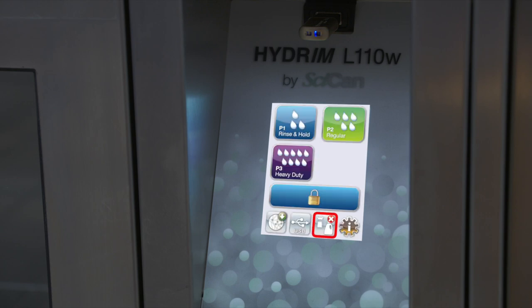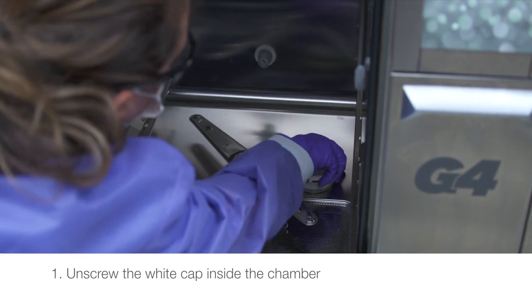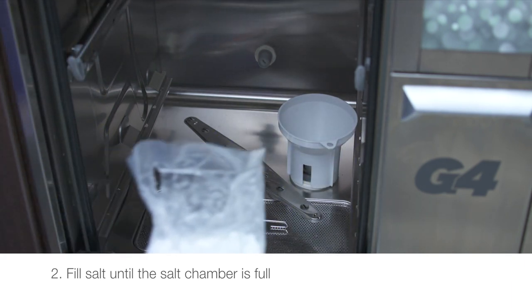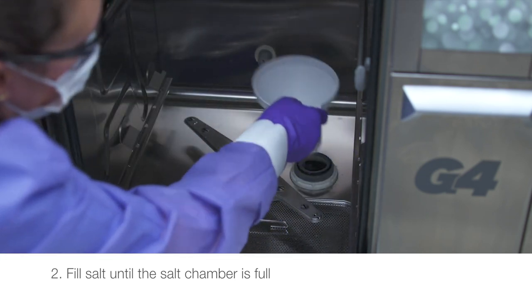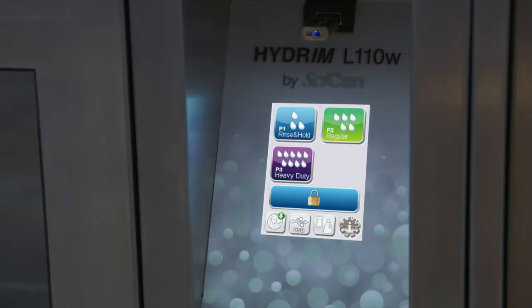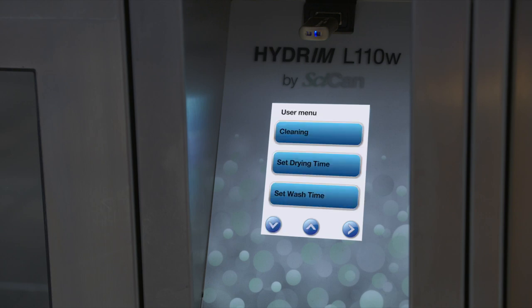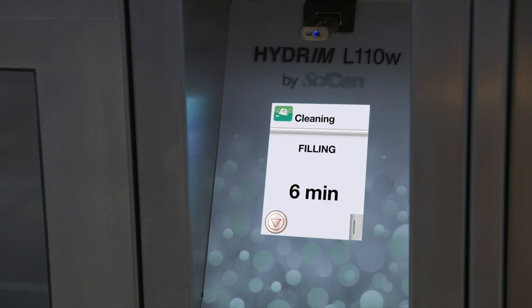If the water softener needs to be refilled, a red X will appear next to it. To refill the water softener, unscrew the white cap inside the chamber and fill with salt until the salt chamber is full. Add water as needed in the salt chamber, then close the salt container lid ensuring a tight seal. Every month, or every 25 cycles, you need to clean the chamber using a decalcifying powder or vinegar. Please refer to your user manual for step-by-step instructions.